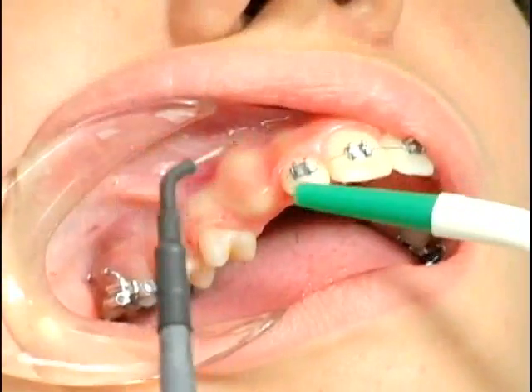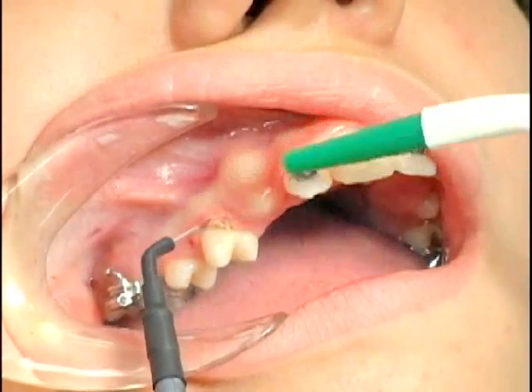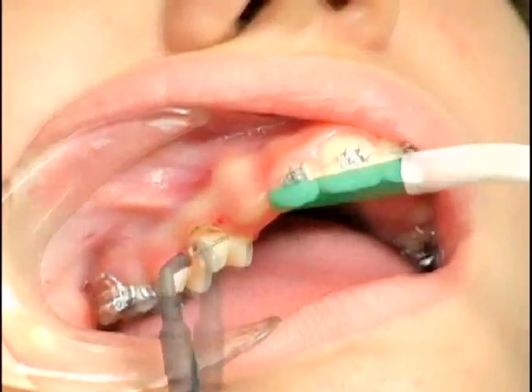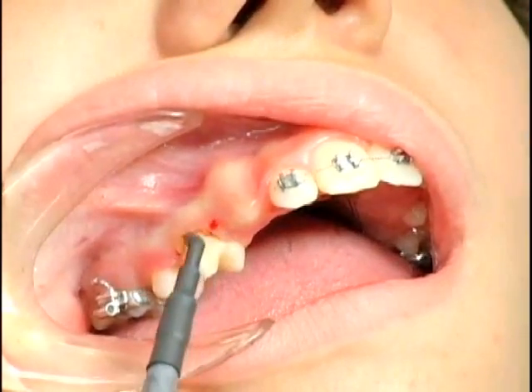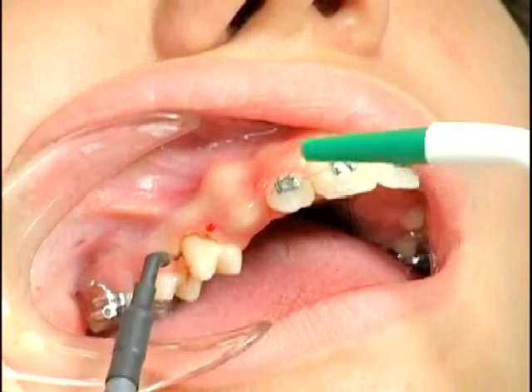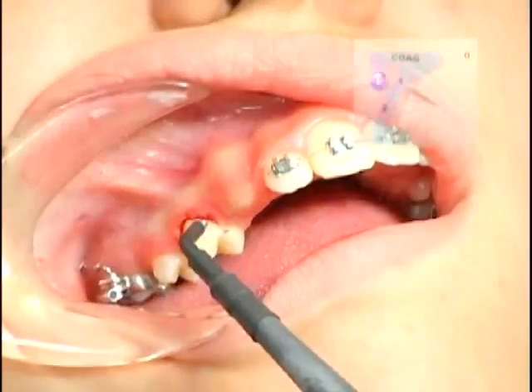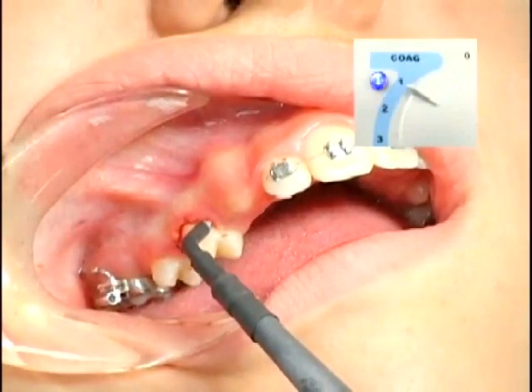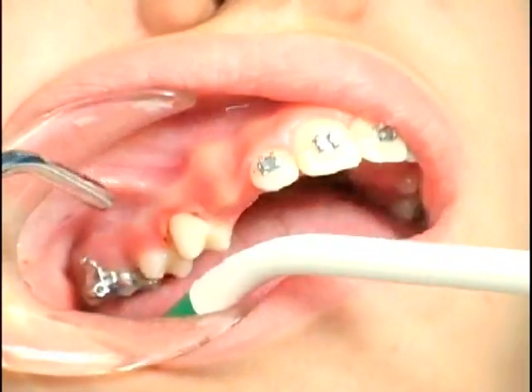Tissue elimination — removing excess gingival tissue to cement braces. If bleeding occurs, it can be readily controlled by coagulation. Use the coag ball electrode for effective coagulation.